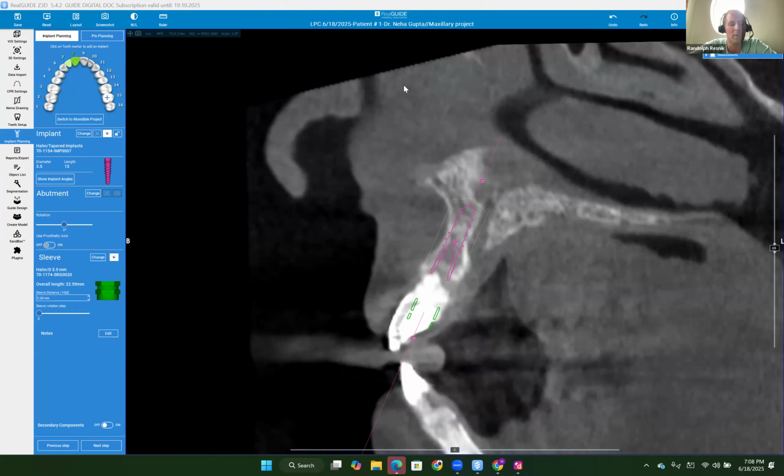Have you used one of them before? No. Okay, so it's pretty much an overlay Essex. It's going to be the most aesthetic because you don't have the clear Essex retainer around it there. It's also going to be the most durable, and it's not going to alter their vertical. So what they'll do is when it's hugging on the posterior teeth, they'll leave occlusal stops on the patient's actual teeth. So that's going to help the most.